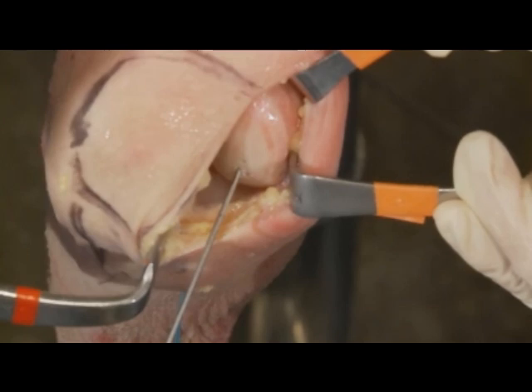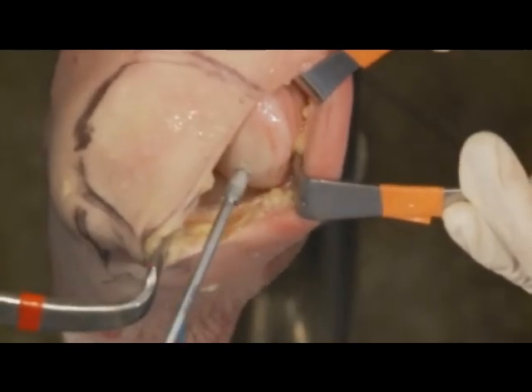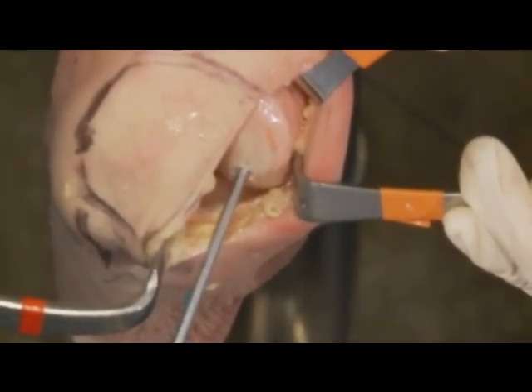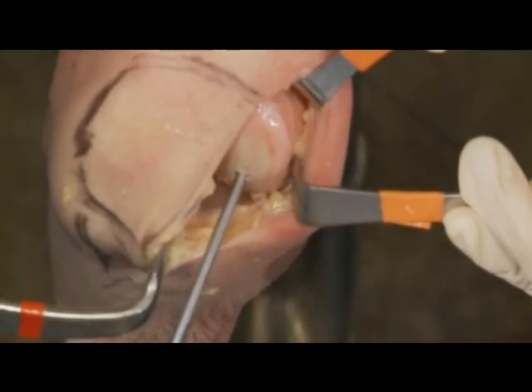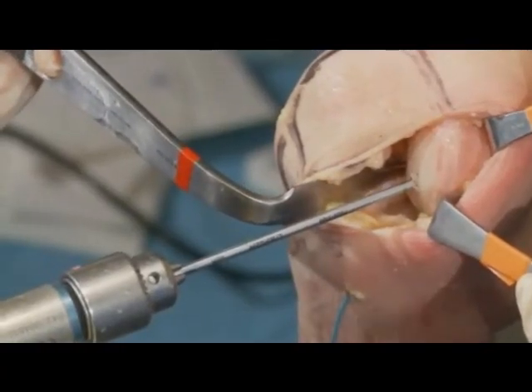So yeah, I'm moving along here. So here is a device, and what this is going to do is it's going to set the height. There's a laser mark on the edge here, and you want this to go to the level of the articular cartilage or the joint line where it used to be. What I like to do is turn it down to a level that's just at the level of the articular cartilage as it was before. Now, check key, please.